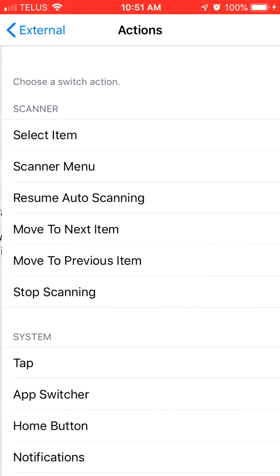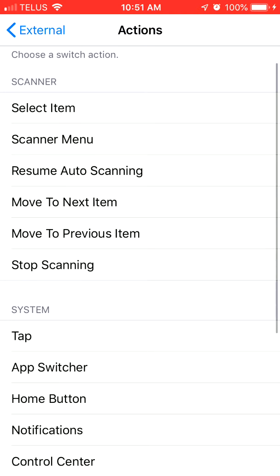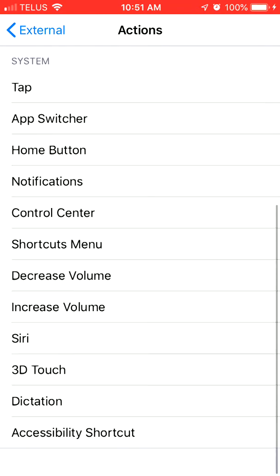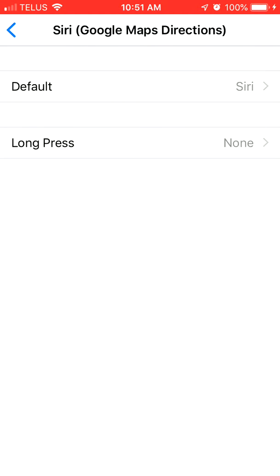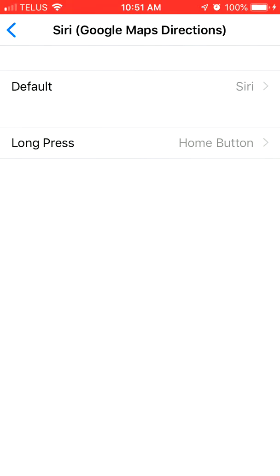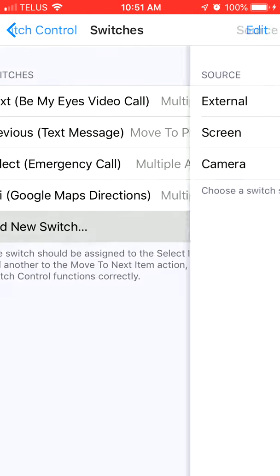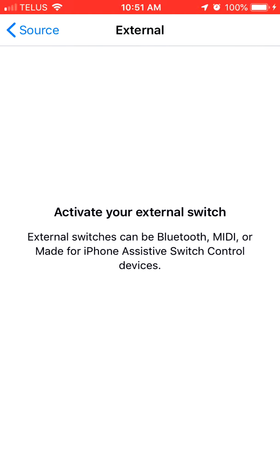And again, we're going to save that. And the action that we're going to assign, the default action will be Siri. And the long press action will be the home button. And then we do have one more switch to add, so we're going to click Add New Switch, External again. And the switch that we're going to click on this time will be the last switch available on the button interface, which is in the lower right corner.